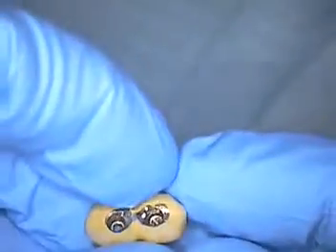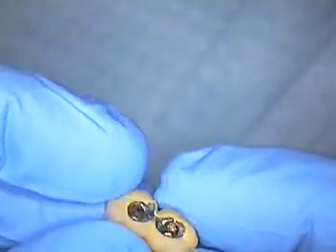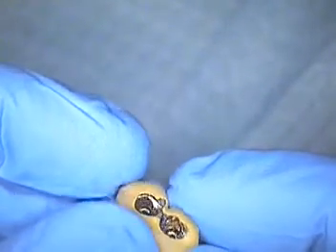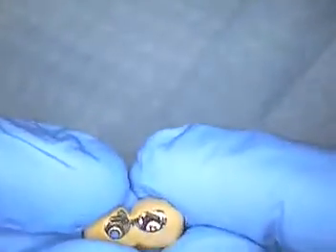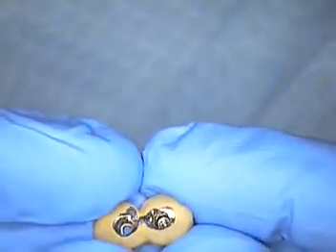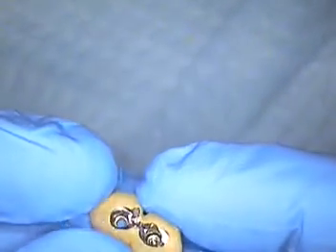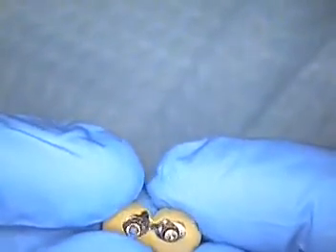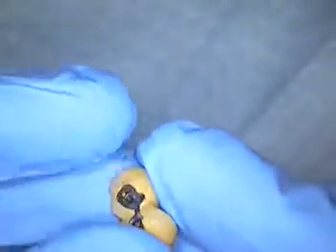For those of you just tuning in, there's a series of videos that are filmed before we filmed this one. This is our last of possibly six that we've filmed. This is our patient's two-unit splinted bridge. It was made many years ago in great shape. Maybe the porcelain's worn a little bit to his bite, but he's looking forward to getting this back in today.